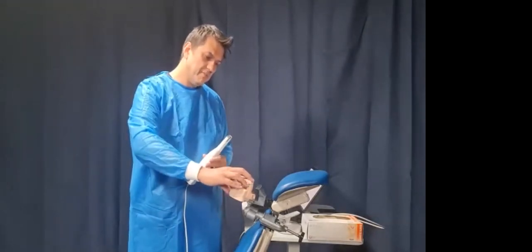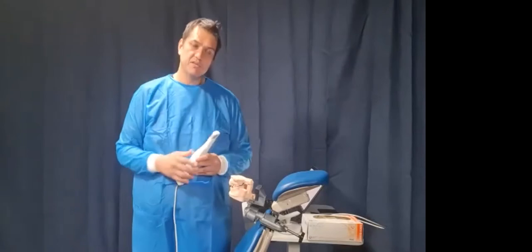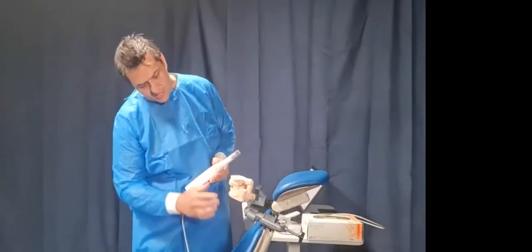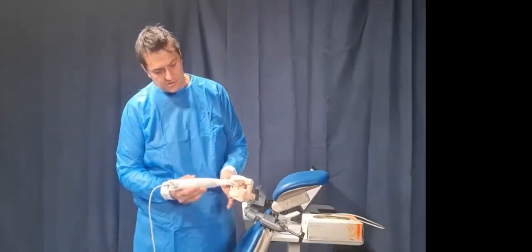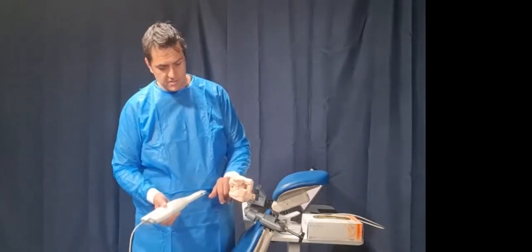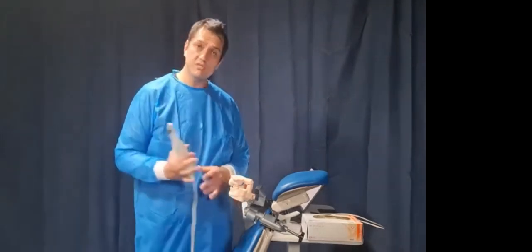I want to talk to you a little bit about my thought process for recording this scan. We have here, our contact points are all here. Again, there's no sense starting your bite record scan here because there's nothing contacting here. It always makes sense to start your bite record where the most amount of hard structures are contacting. So if I had one tooth, for example, in quadrant 4 lower, contacting with the upper, I still would start here because there's more hard surfaces on that side.